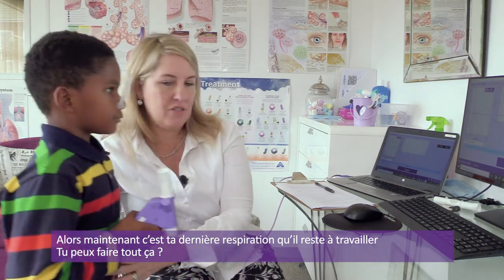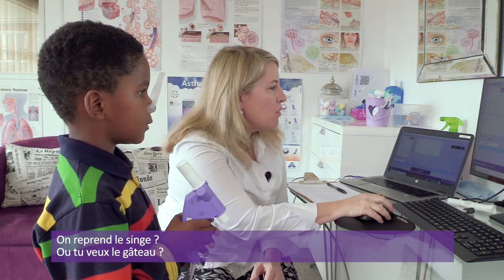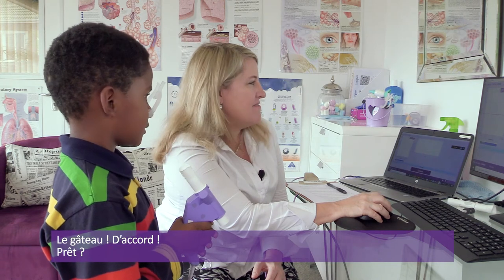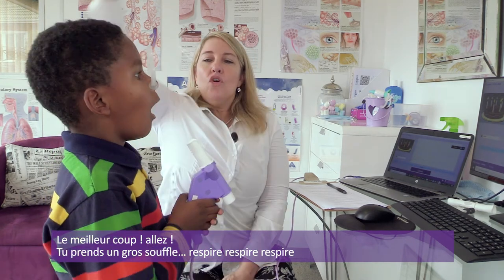Okay, let's go. Let's just turn a little bit this way. Okay, how are you feeling? All right. Wait. Let me give you, what do you want? The monkey? Or do you want the cake? Cake. The cake. All right. Okay. Right, are you ready? Your best shot. Okay, take a deep breath in. Fast as you can.